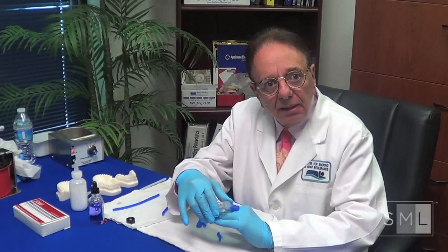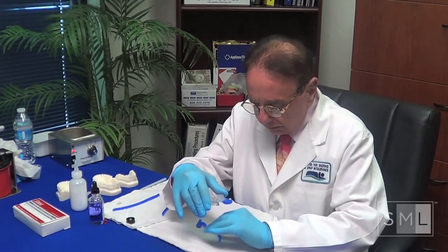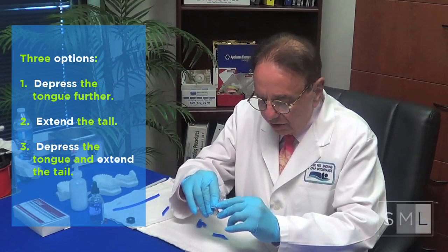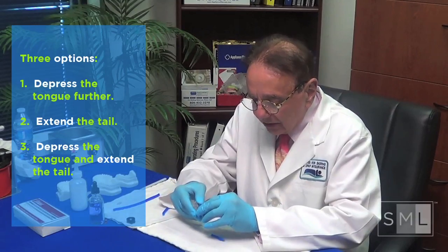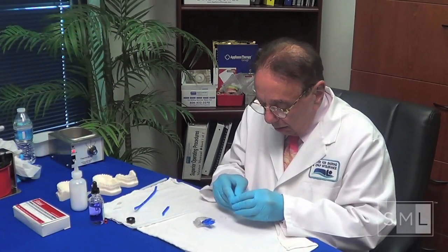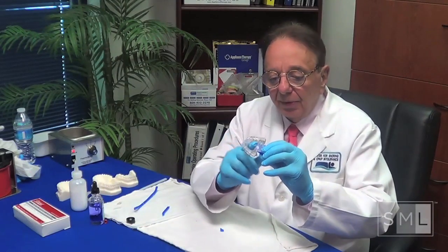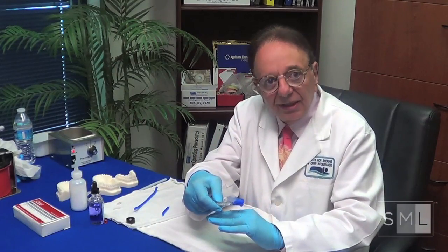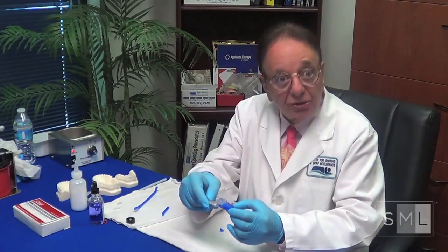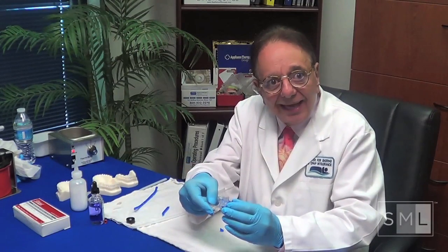If they come back in two weeks saying they're still snoring some, at that point we've got one of three choices. One choice is we can add wax and do the same thing, adding it all the way from front to back and depressing the tongue some more. We take it to the lab, try it in the mouth — it's comfortable, they can take it, we've taken steps. If something is too long or too much down, we make it smaller. They tell you the last thing added is too much — you make it smaller. Then we go ahead and enlarge again incrementally.